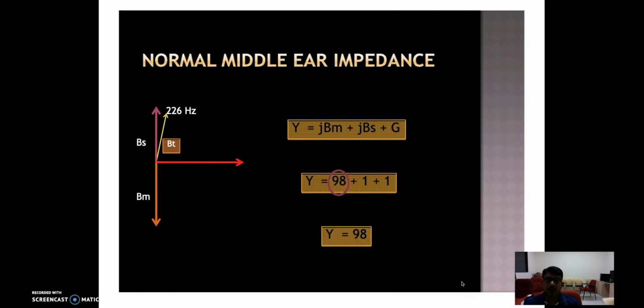Yeah, so coming to the main part, that is how to estimate an impedance. Okay, so we know routine tympanometry, that is 226 hertz probe tone. Unless, like what you have seen in a typical representative diagram, it flows very close to the stiffness axis.